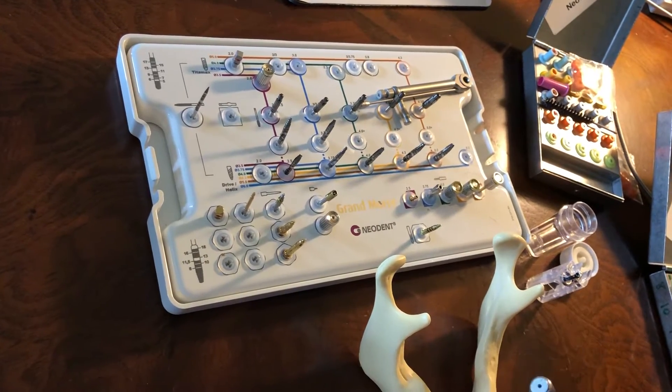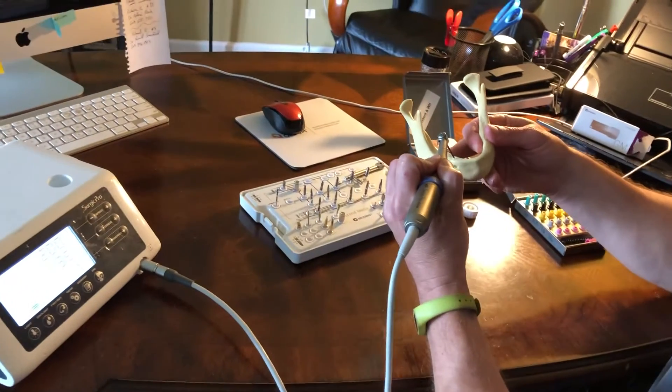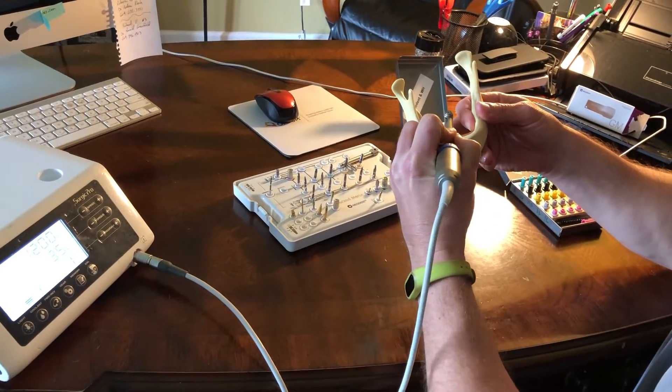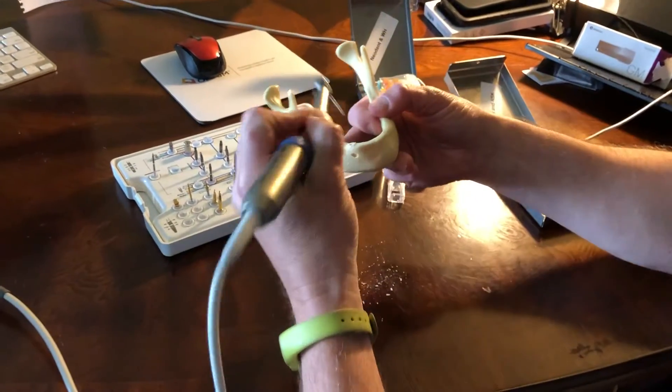The problem is if we're drilling and we don't have something to help us stop, we don't want to change our angle too much, but more so plunge too deep and numb the patient.